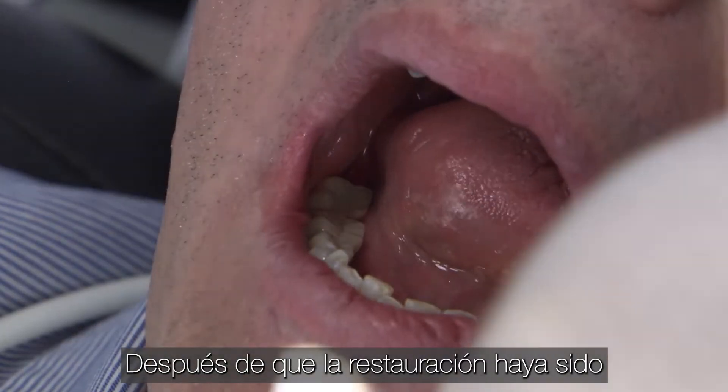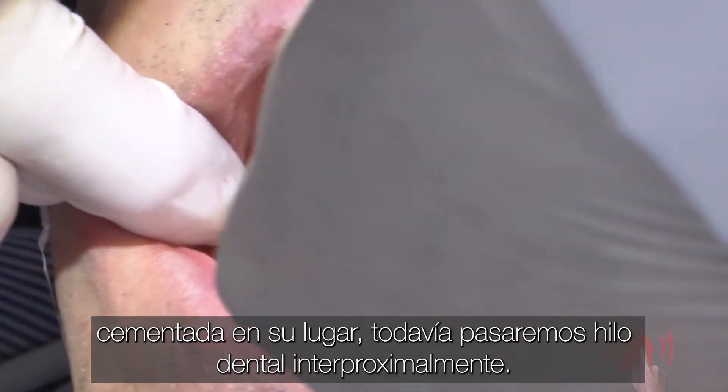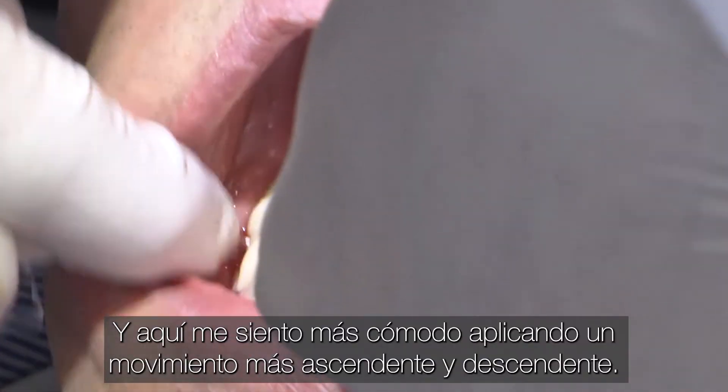After the restoration has been cemented into place, we'll still pass floss through interproximally, and here I'm more comfortable applying a more up and down motion.